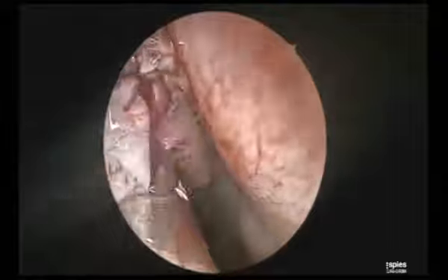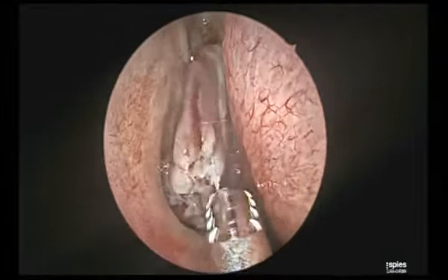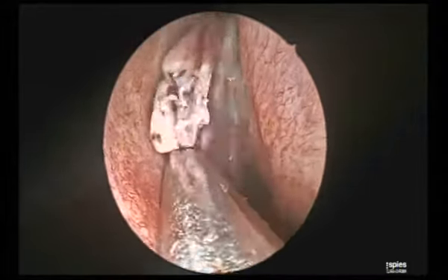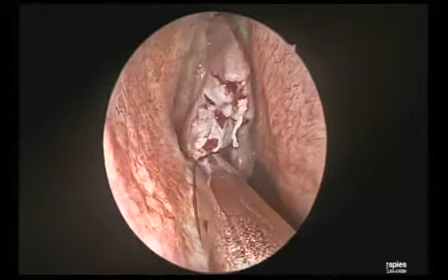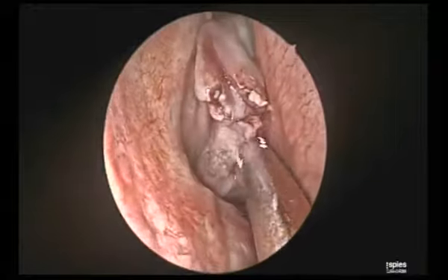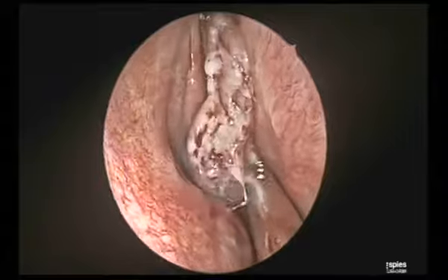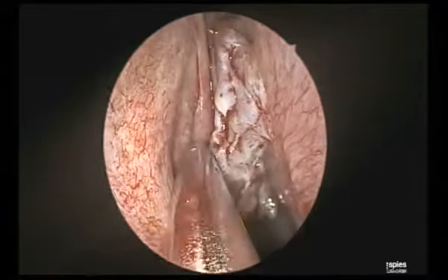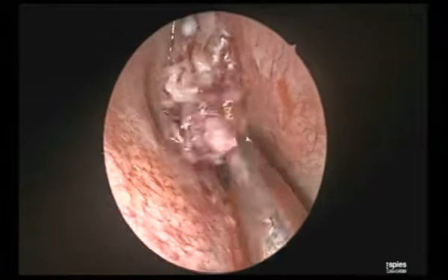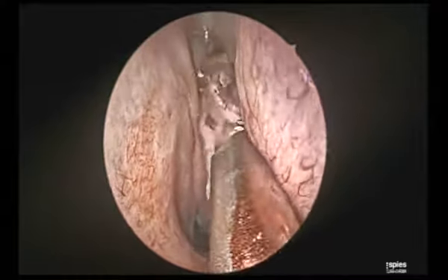So other side, no other structure is visible. These are polyps. I am taking away these polyps. So no infiltration, nothing, just started. Of course, he did his topical a little bit. Ashish, infiltration is a thing of the past now. I can't afford to take a possibility; in fact, it will increase the heart rate. Yeah, definitely. If it goes in the system, even mortalities have been reported now in the literature. See all this polyp, where is it coming from? The middle turbinate, actually. Yes, it's coming from the roof. It has actually lateralized the middle turbinate. This is funny. See where it is coming from.